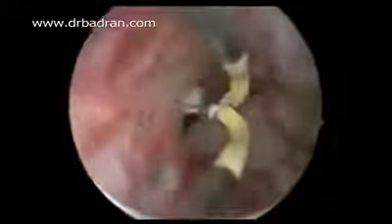and also by noting that the level of the new upper part of the uterus, the fundus, is at the same level more or less with the openings of the fallopian tubes on the right and on the left. This is the opening on the right side.